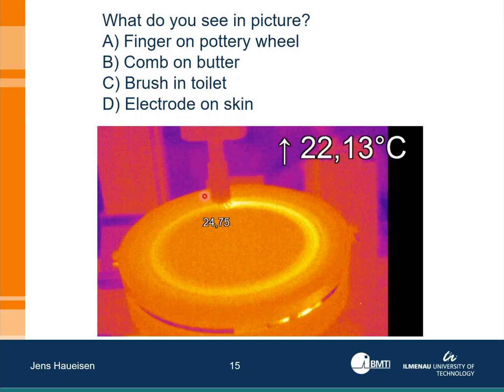And this is a thermography picture. The reason why we did this was to see how much temperature increase we have when rotating this disc. So the temperature would be an additional cofactor for the wear off. In this case, the temperature here is 24 degrees roughly, and the room temperature is about 22 degrees. So we have about 2 degrees of increase. And that was done in order to adjust for speed. We typically do a few thousand rotations, and that means you have to wait longer if you do it slower.